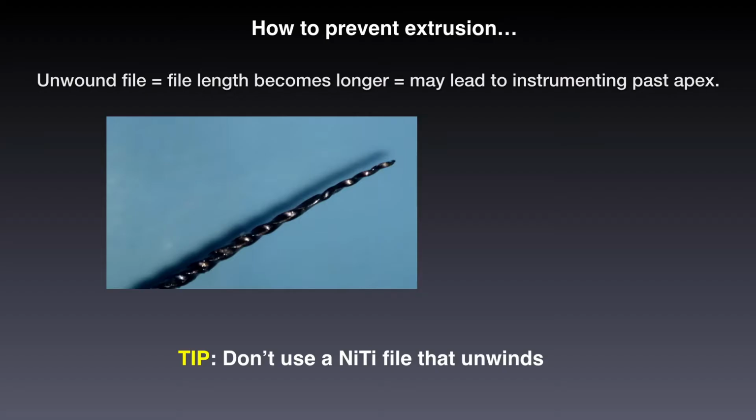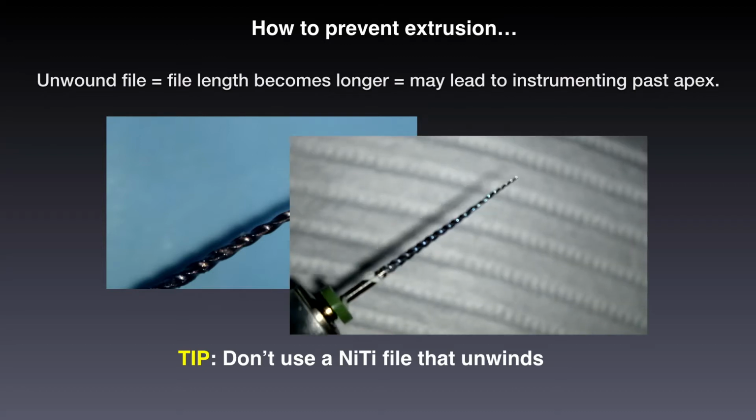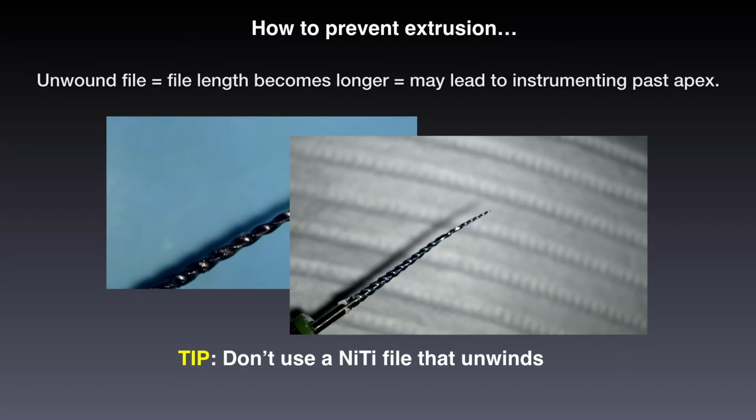So unwinding files, for me, is a huge issue. We should talk about it just as much as we talk about broken files, because the damage that they do to the apical part of the root is very, very significant. So the bottom line is, please try not to use nickel titanium mechanized files that unwind, okay? Try and do your best.